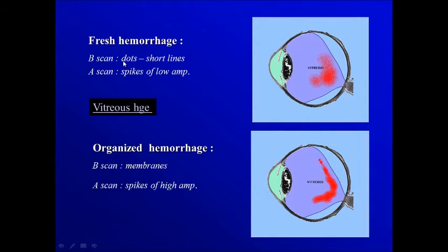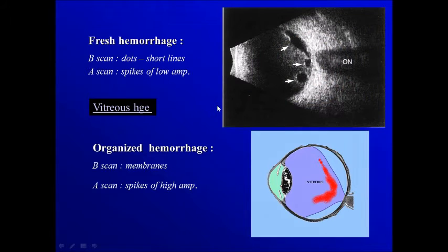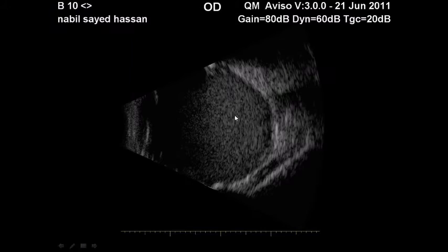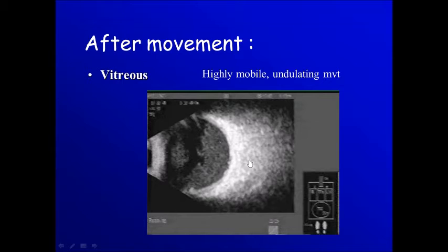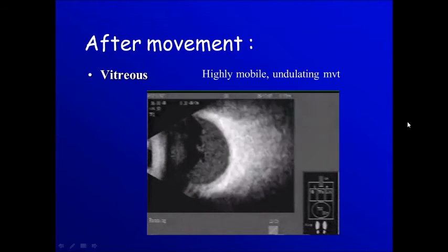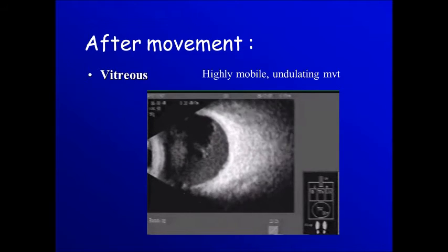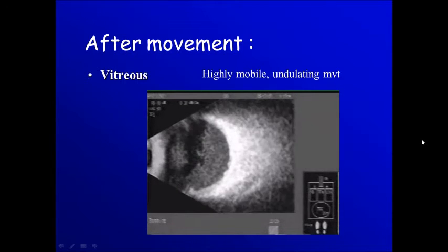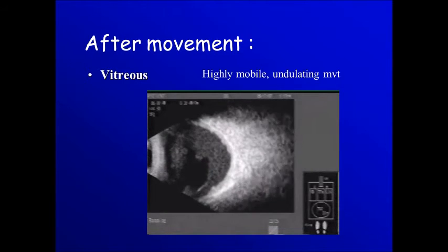Hemorrhage: if it's a fresh hemorrhage it will appear like dots in the cavity on B-scan. If it's an organized hemorrhage then it will be in the form of membranes. You can see the difference between these fine dots here and this condensed hyper-reflective membrane. The vitreous cavity is filled with fine dots, and with the movement of the eye you can see the movement of the vitreous gel filled with these dots.